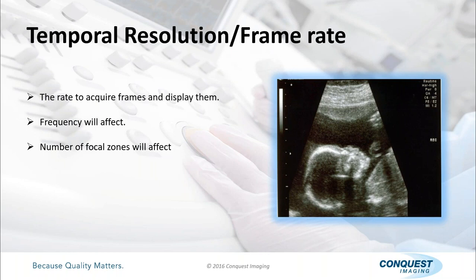I would say most of the probes, and this is again general, I wish there were a naming convention that made sense, but a 2 to 9 megahertz probe, I would say that the base frequency for penetration would be 2 megahertz, and the resolution would be 9, and somewhere in the middle, 4.5 would be your general resolution rates. But there's nowhere for me to know that.